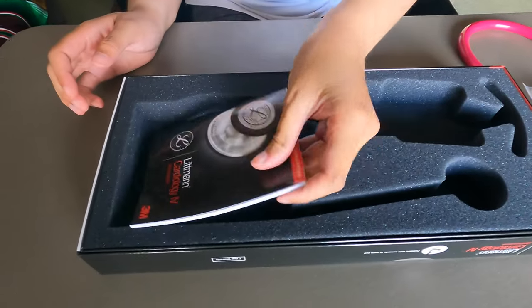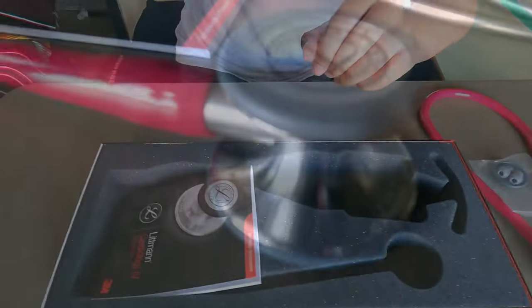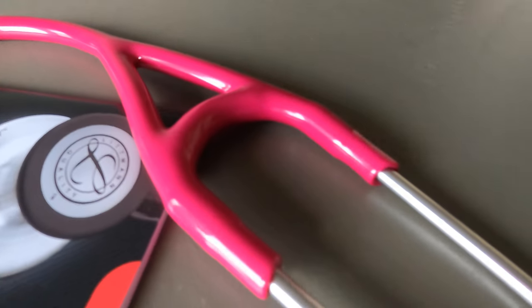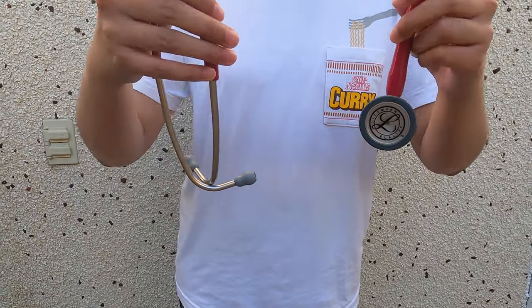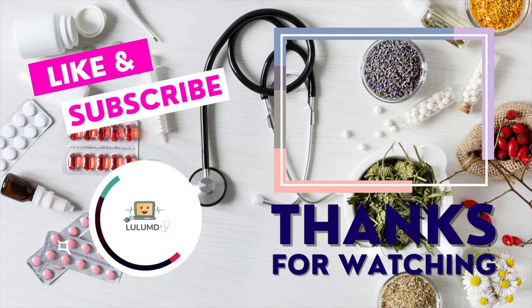I hope you really enjoyed me unboxing my stethoscope. I'm really excited to use it — let's try it on and see how it looks on me. Let's go!